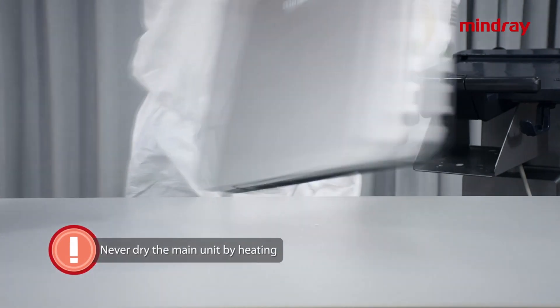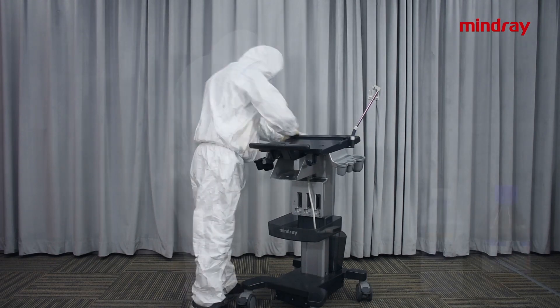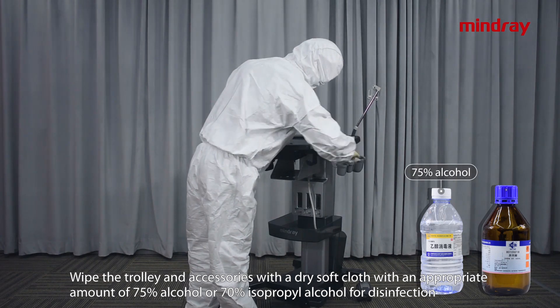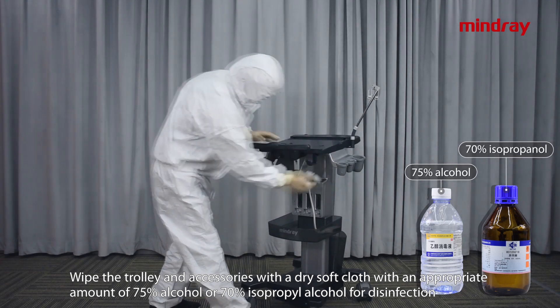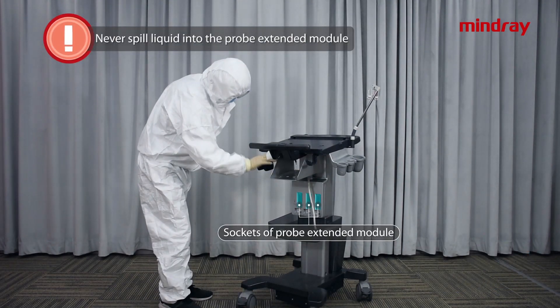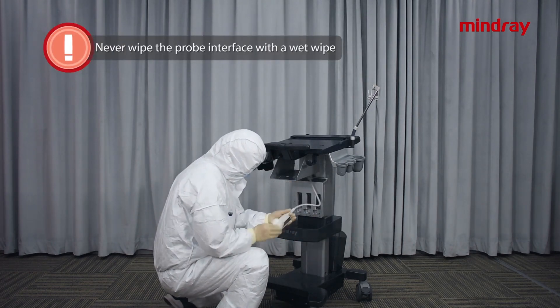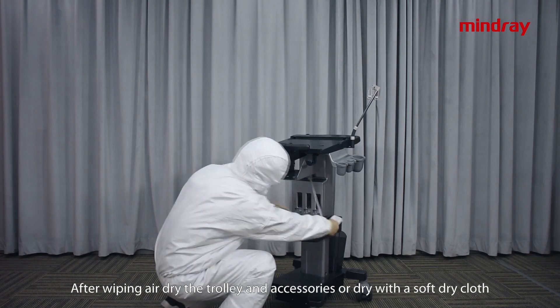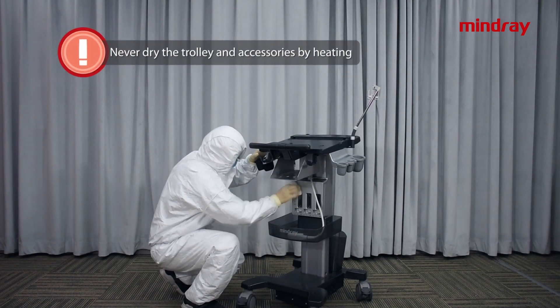Trolley and accessories disinfection: wipe the trolley and accessories with a soft dry cloth dampened with an appropriate amount of 75% alcohol or 70% isopropanol for disinfection. Caution: never spill liquid into the probe extended module, and never wipe the probe interface with a wet wipe. After wiping, air dry or dry with a soft dry cloth. Never dry the trolley and accessories by heating.